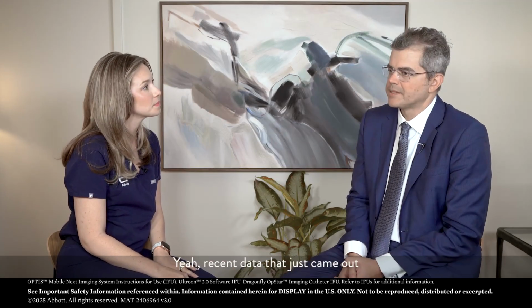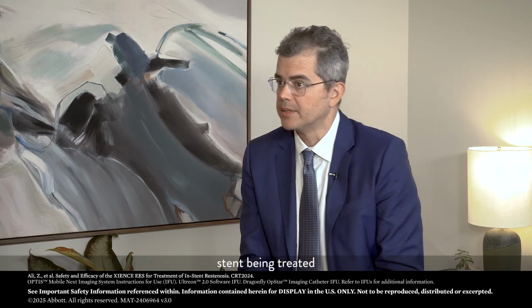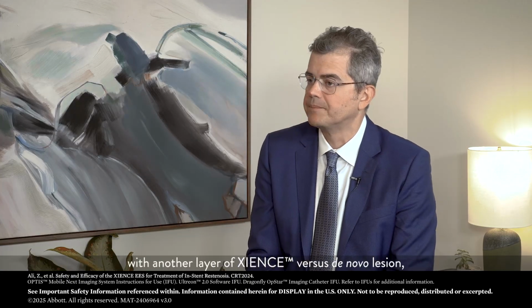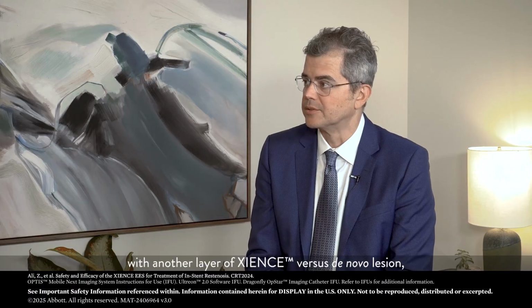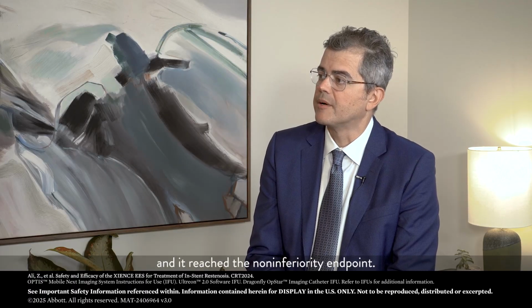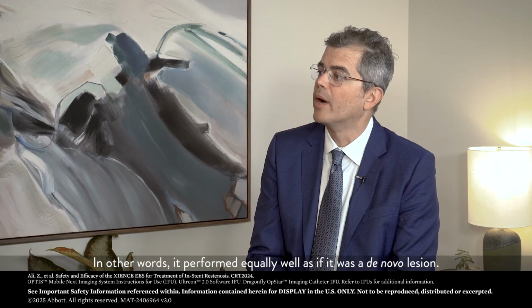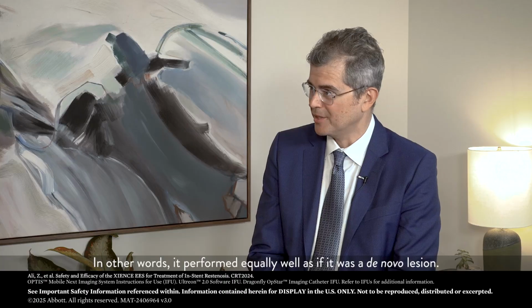Yeah, a recent data that just came out, part of a pre-specified endpoint on iLumen 4, is a direct comparison of a single layer stent being treated with another layer of Xience versus the de novo lesion, and it reached the non-inferiority endpoint. In other words, it performed equally well as if it was a de novo lesion.